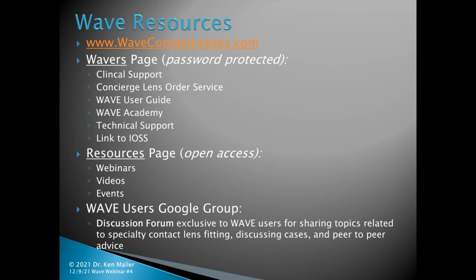Exactly. Perfect. I have a question kind of asking about your methodology and why not use freeform for all of the cases? What are kind of the benefits of using like R-Sym or G-Sym?